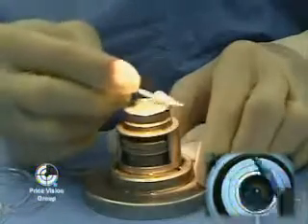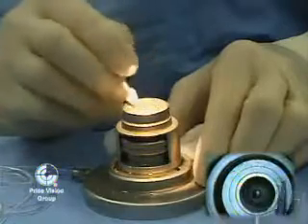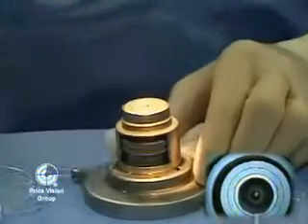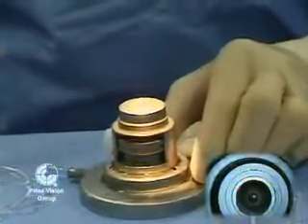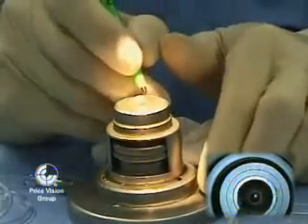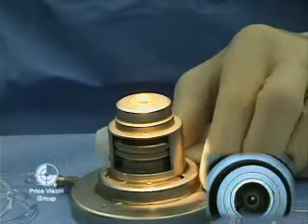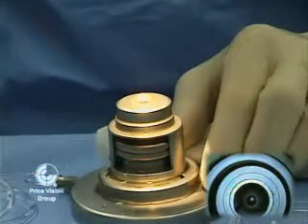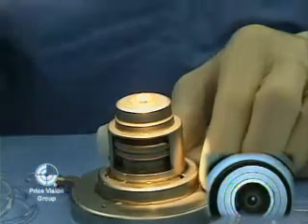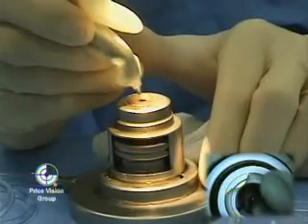What I routinely do is remove the epithelium from the surface of the donor cornea. We do this for two reasons. One is that the epithelium can be irregular after it's been in tissue storage solution for a while, and it may have a defect just from when the donor was before they were harvested. You might have an area in the palpebral fissure area that's dried out. The other reason is that I want to make it thinner so that we get a deeper resection with the microkeratome. Now, I've made a mark with gentian violet, and this will be a reference mark for after we resect the anterior part of the cornea for placing it back in position.